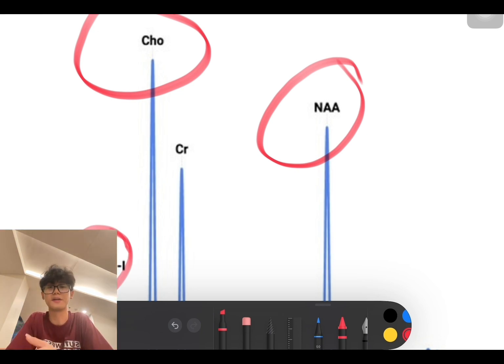In clinical practice, a typical glioma MRS protocol uses a conventional MRI paired with multivoxel imaging or the CSI to acquire spectra from multiple contiguous voxels within a defined slice, which provides a spatial mapping of the metabolite distribution, as you can see from the graph. For the specific parameters, the TE, the TR, and also the voxel size will be tailored based on the clinical question, the characteristics of the tumor, and the scanner capabilities, which is useful for tumor heterogeneity, infiltration, grading and diagnosis.